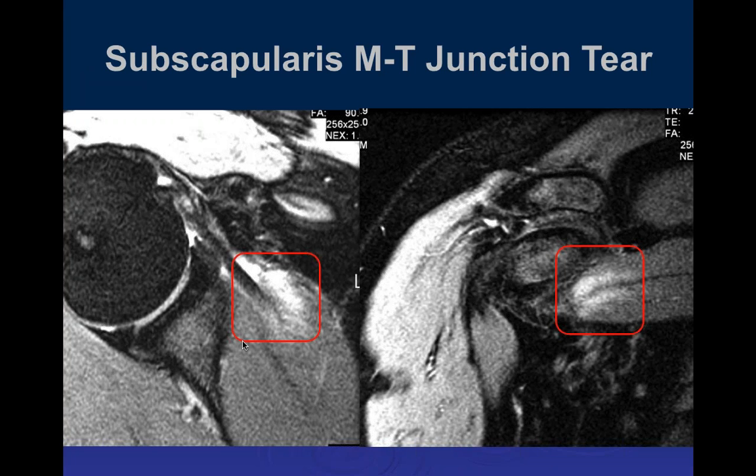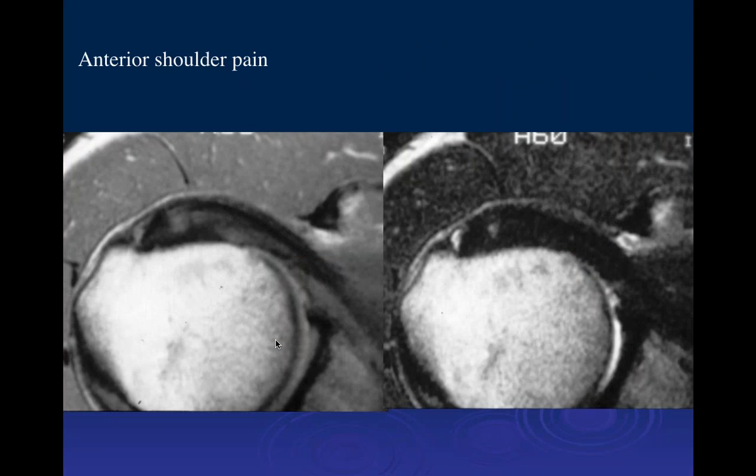Myotendinous junction injuries of the subscapularis are extremely uncommon in adults over 25-30 years old, because the weak link at that age is almost always the tendon. This is an athlete with massive muscular hypertrophy, and this is a typical location of tears in young athletes at the musculotendinous junction. Here is a patient who had anterior shoulder pain with a partial tear within the more distal subscapularis tendon.